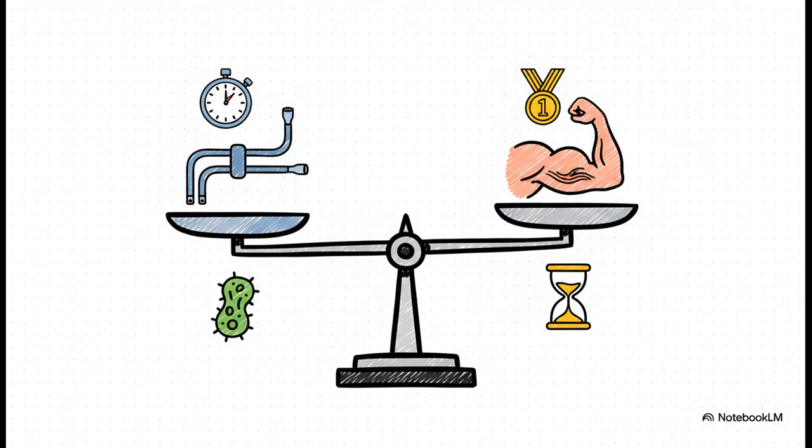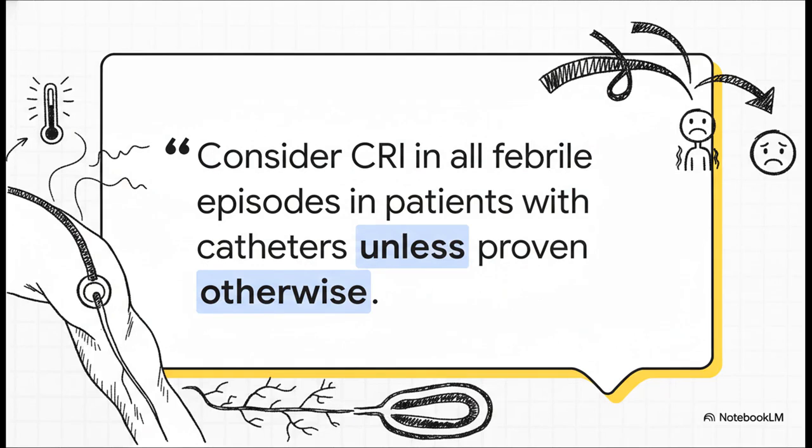This slide really shows the essential trade-off in vascular access. A tunneled catheter, yeah, you can use it right away, but it carries a high risk of infection and is tied to worse long-term outcomes. In contrast, an arteriovenous fistula, or AVF, where a surgeon connects an artery directly to a vein, that's the gold standard. It has a much lower infection risk and can last for years and years, which leads to better survival. The only catch? It needs time to mature. So the crucial point here is this. Until Mr. Lim gets that fistula, his catheter is his biggest vulnerability.